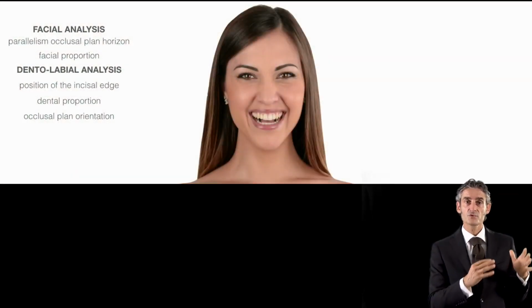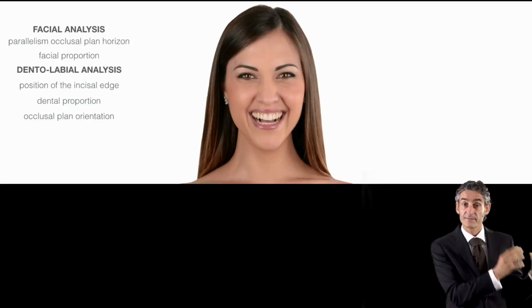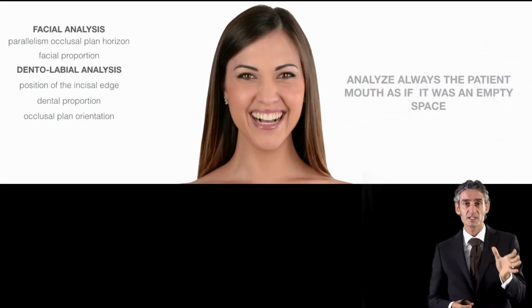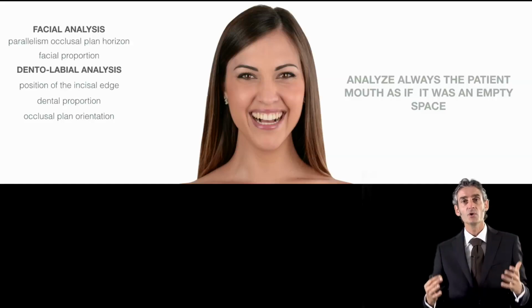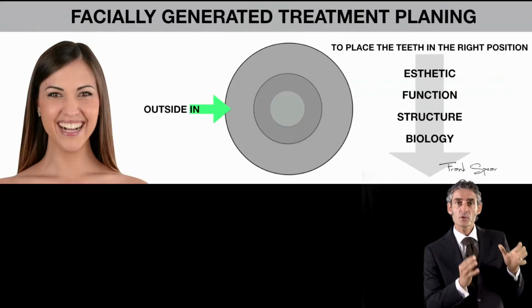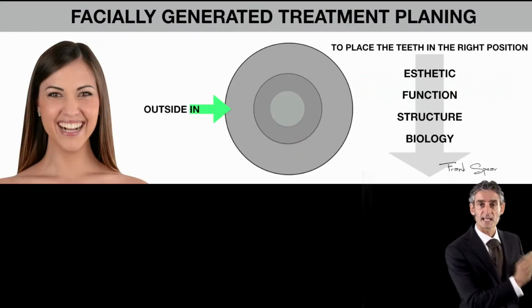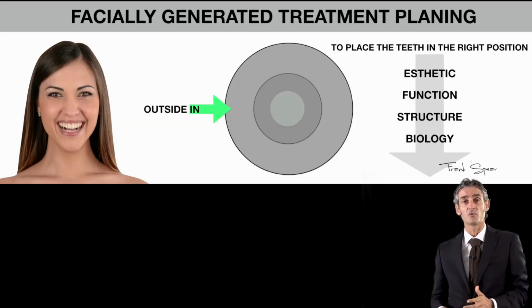So every single time we start a new case, for sure it's important to make an aesthetic analysis, labial dental analysis, and the facial analysis of the patient. And remember that it's only when you consider the space between the lips as an empty space and you create the ideal restoration, you will be able to finalize the case in the best way. So our treatment plan must always be facially generated. So we start from aesthetic, then function, structure, and biology in the way to create a predictable result in the patient's mouth.